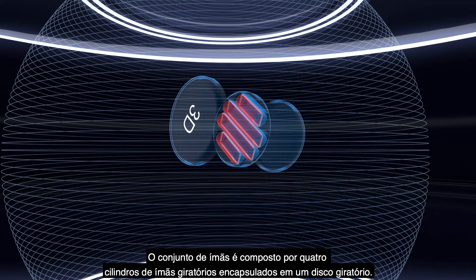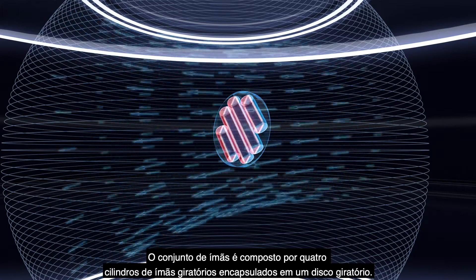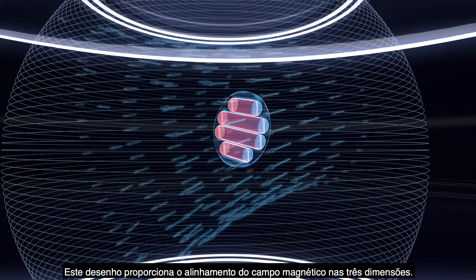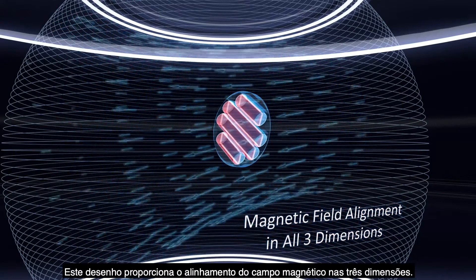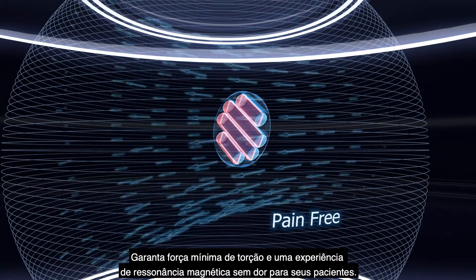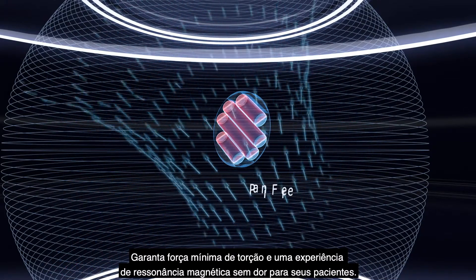The unique magnet assembly is composed of four rotatable magnet rods encased in a revolving disc. This design provides magnetic field alignment in all three dimensions, ensuring low torque and a pain-free MRI experience for your patients.